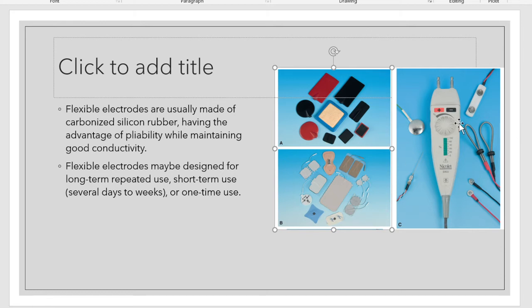Then we have metallic electrodes. These are examples of metallic electrodes used for implants, like the needle or pins. If it is implanted, that is where you attach it.